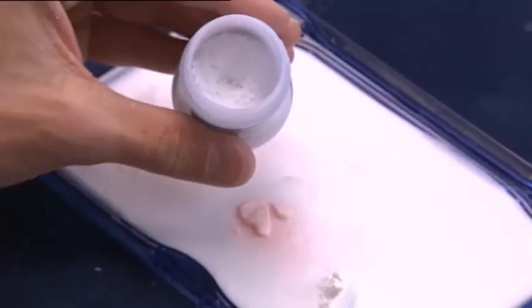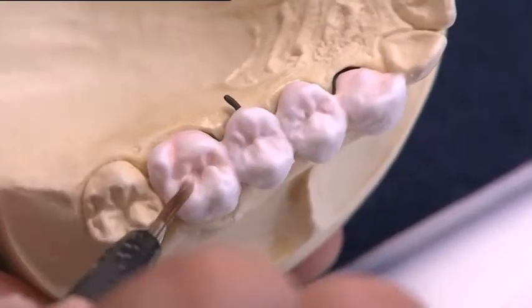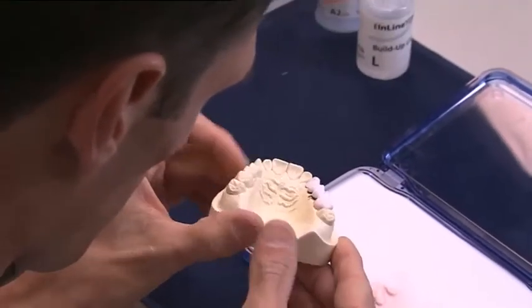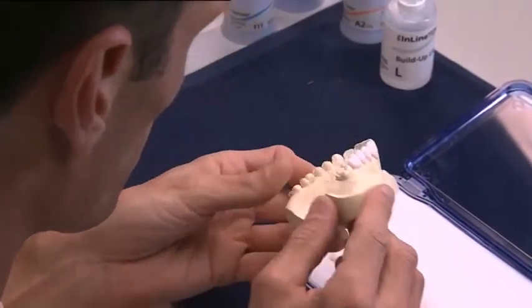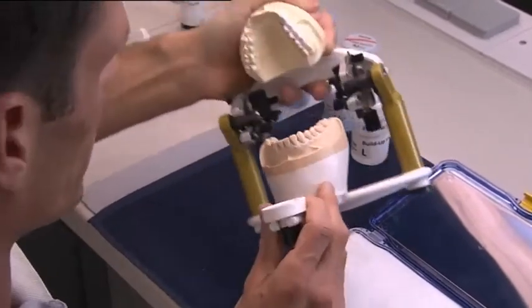Transpa incisal is mixed with the buildup liquid and applied from the incisal up to the incisal third and occlusal area in small portions. The anatomical shape is slightly over-contoured.